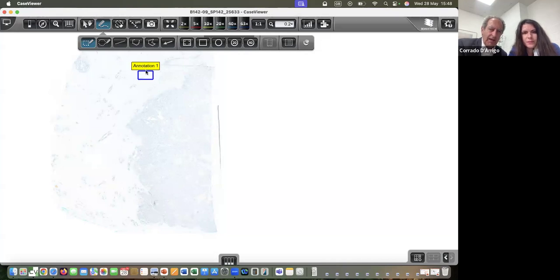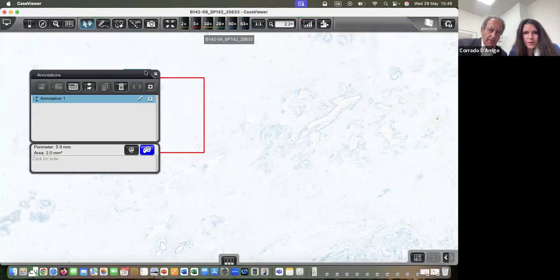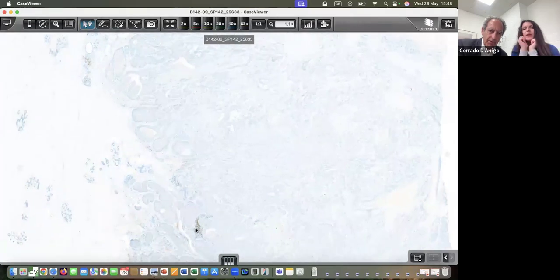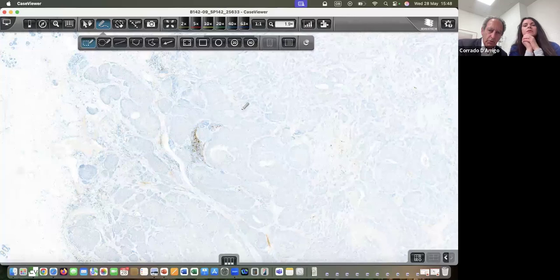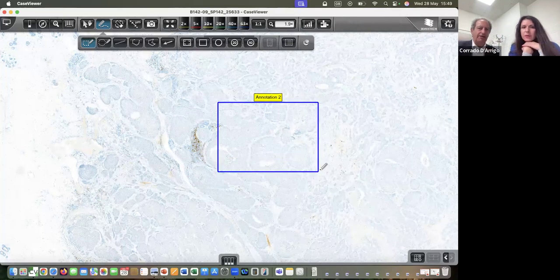Now, I find this very useful. So take this one. Oh, just a moment, I made some mistake. How do you move it? No, you don't move it. You can see the area we need to fill, okay? And then let's go to the areas that are rich. Shall I create another one here? Yeah, good idea. How much was it? 2.0. Go more. You're at 1.2. Okay, this is our target.